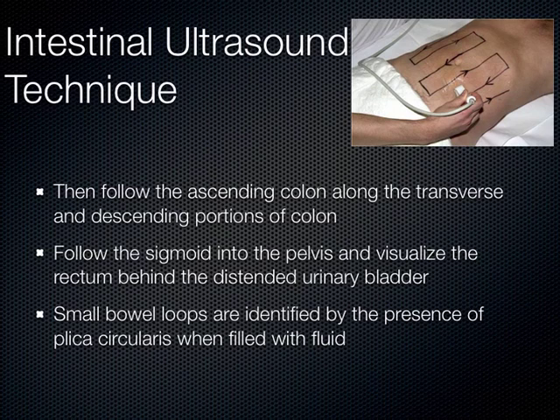When I'm doing a focused appendicitis exam, which I do quite often in the ER, I keep this mowing the lawn technique just around the right lower quadrant where the appendix is located, down there, what we call McBurney's point. Or sometimes I just hand the transducer to the patient and say, put this where the pain is. And then they start to push it on their abdominal wall, and they kind of help to localize where I should start my search for the etiology of their pain.